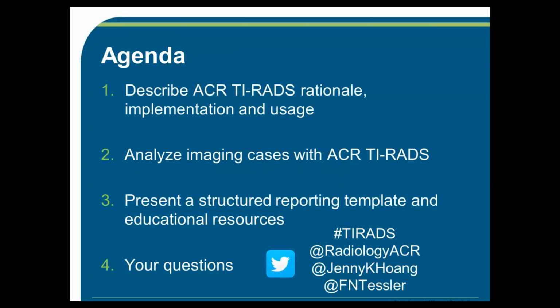And here is the agenda. When we got together, we decided that one webinar was not enough. So we have three, and I'll tell you about the others later. But first of all, the agenda is for Franklin to take over first, and he's going to describe ACR TI-RADS. He's going to tell you about the rationale of the committee, and he will give you some tips on implementation in your practice and how you can use it.